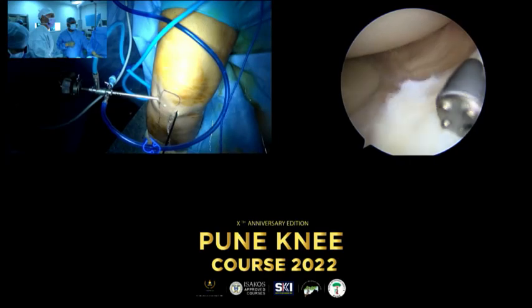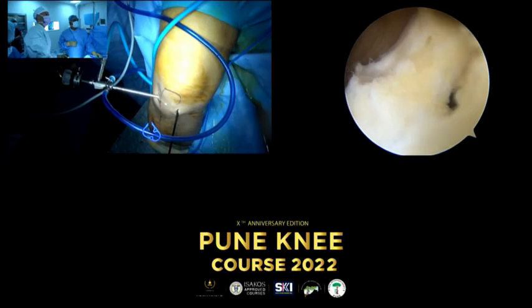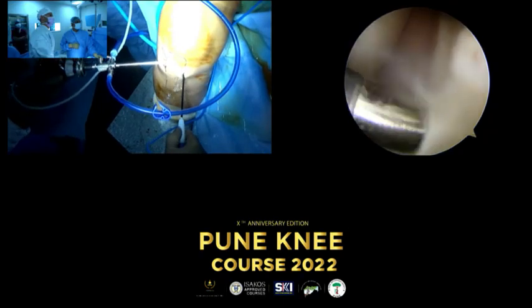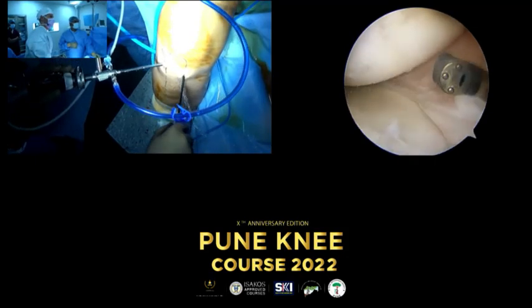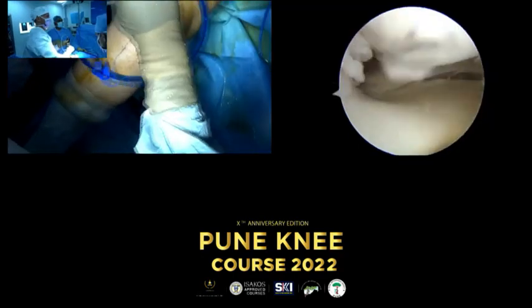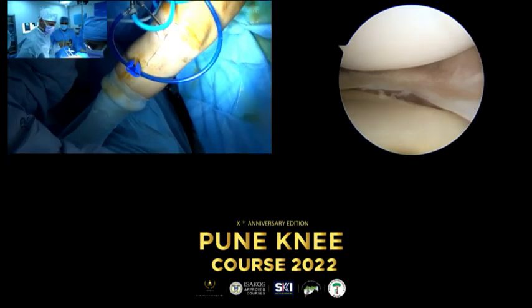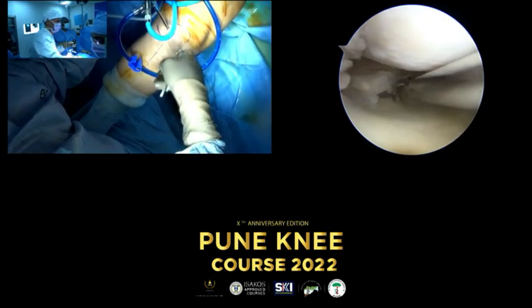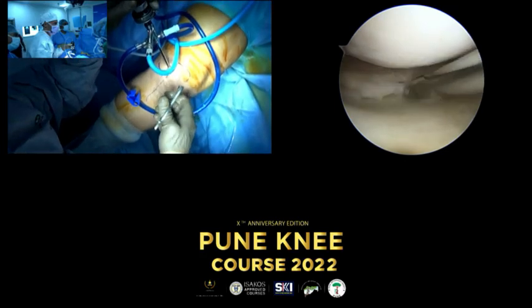Okay, you see here. This is 2 minutes of time invested, so later it will be much easier. Now I will resect this rim of a big one. Not much, because I like to have some remnant, but something more straight, not this kind of thin lip.